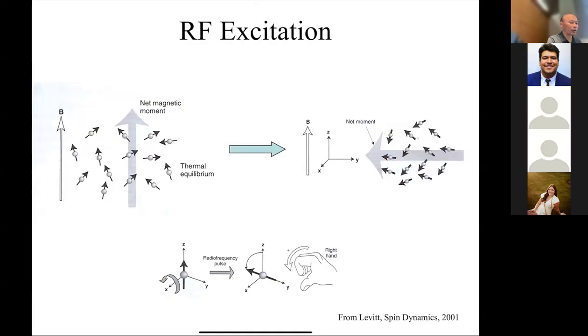Are there any questions about polarization? Polarization, once again, is just this concept of creating that magnetization. And then that magnetization is going to precess. We'll spend the last 15 minutes talking about RF excitation.